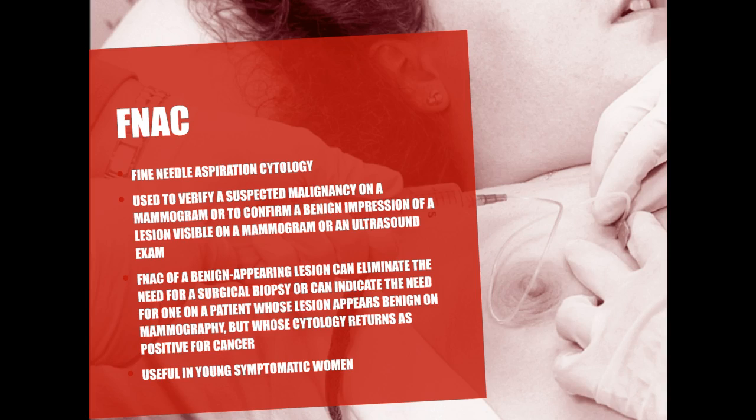And then we talked about fine needle aspiration cytology. It's used to verify suspected malignancy or to confirm a benign impression of a lesion that's visible on a mammogram or an ultrasound exam. Fine needle aspiration cytology of a benign appearing lesion can eliminate the need for surgical biopsy if it's negative, or it can indicate the need for one on a patient whose lesion appears benign on mammography, but whose cytology returns as positive for cancer.